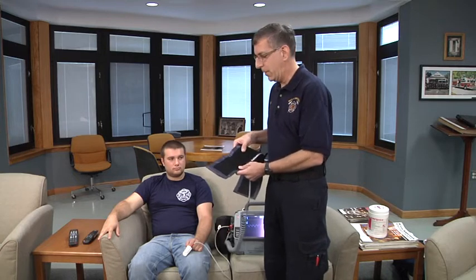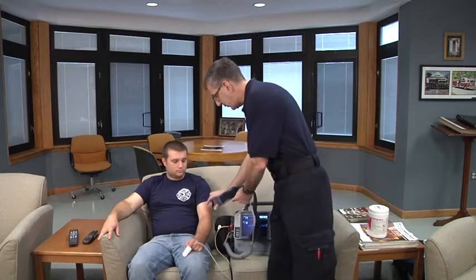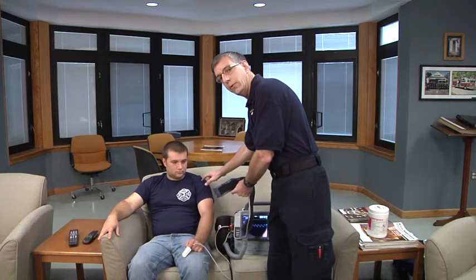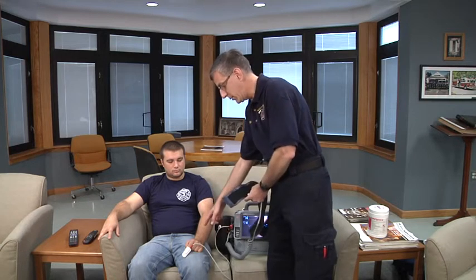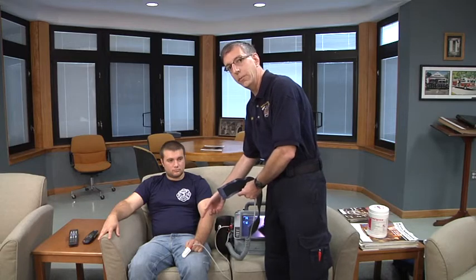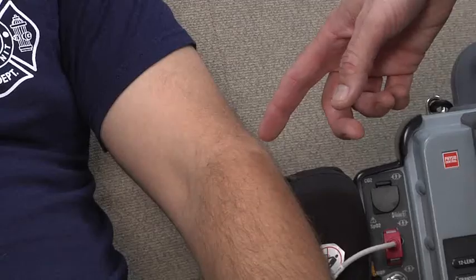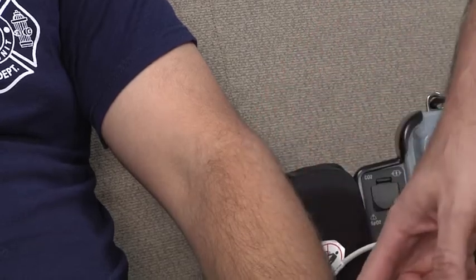That can be simplified by selecting a cuff whose width covers two-thirds of the distance between the shoulder and the elbow. Or if you were measuring blood pressure on the lower arm — for example, in a patient who is extremely obese — you would choose a cuff that covered two-thirds of the distance between the elbow and the wrist.